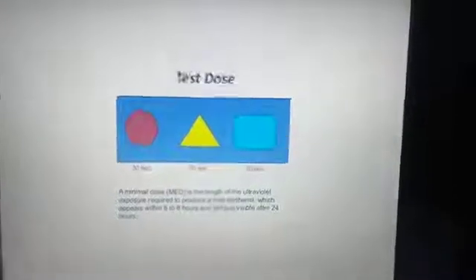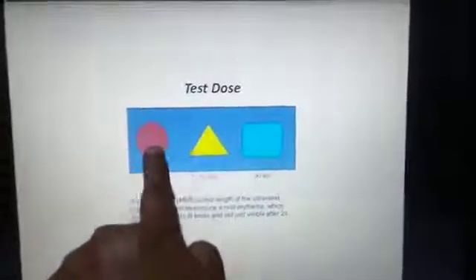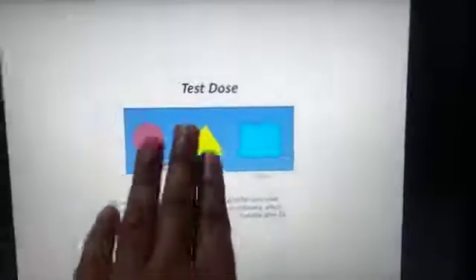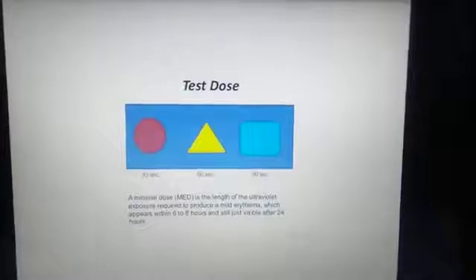These shapes have to be cut down. If you take a cardboard like this, these shapes have to be cut out. So you put this onto the forearm aspect of the body and then after that, one by one you expose that area.